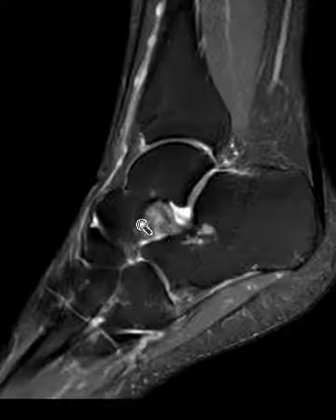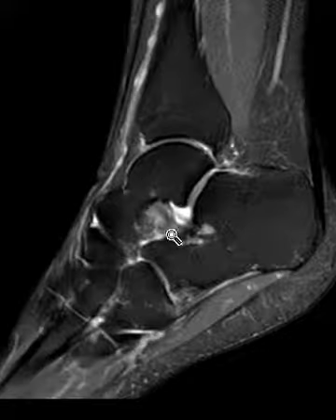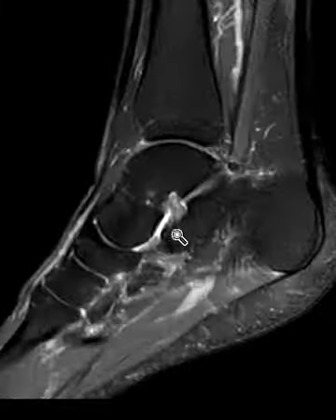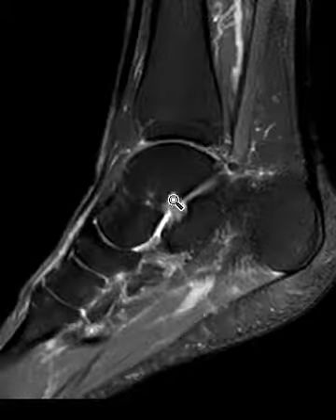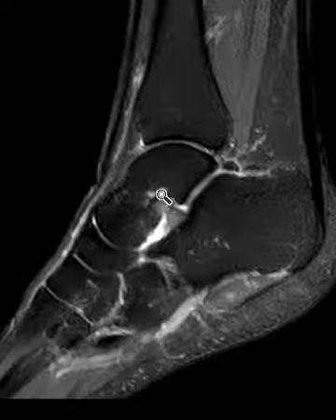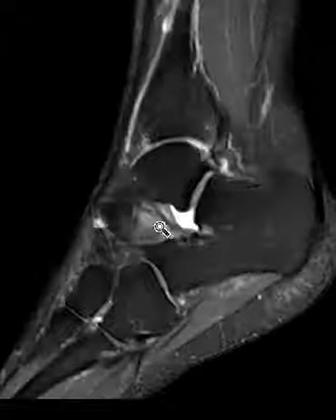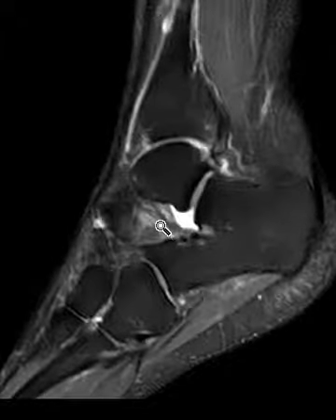So it's part of the sinus tarsi, the superficial component. If we go in here where it's cupped, in this area is the cervical ligament, and I can see these linear strands that look like the fibers are intact. If we go back here, we start getting into the talocalcaneal interosseous ligament. Here it looks like I do see some fibers, but there's some little erosive changes around the sinus tarsi, and it looks a little foggy and a little bit of brightness within the fat. There should be more dark in fat suppressed.